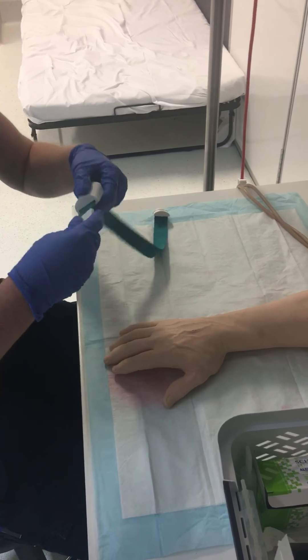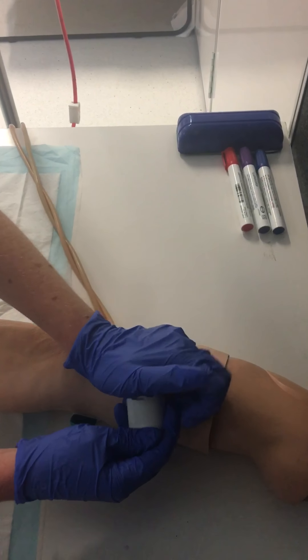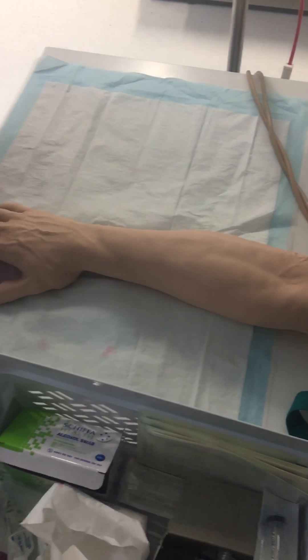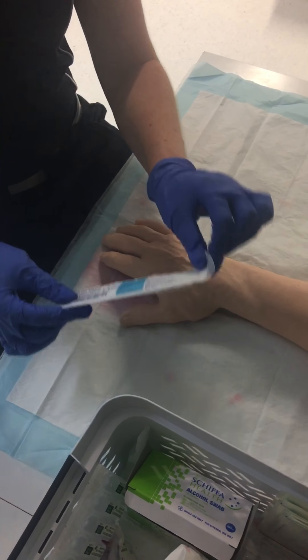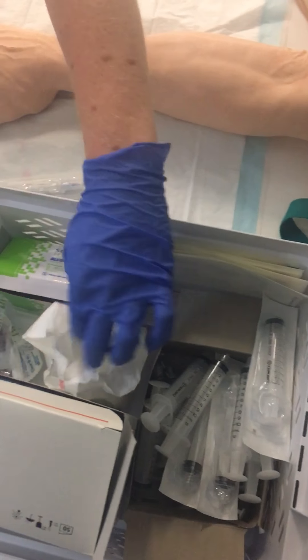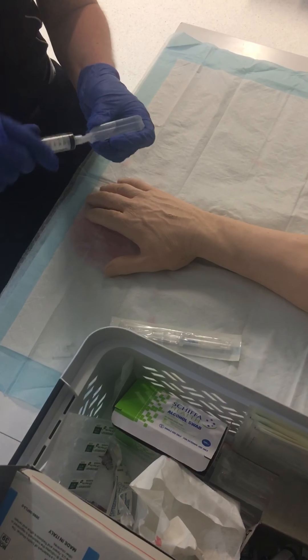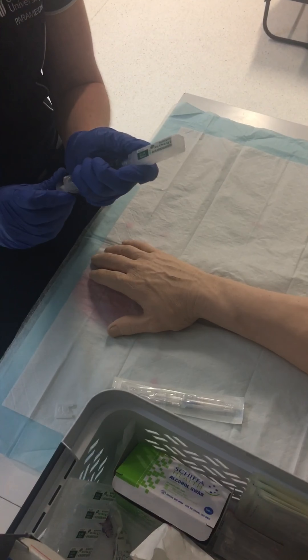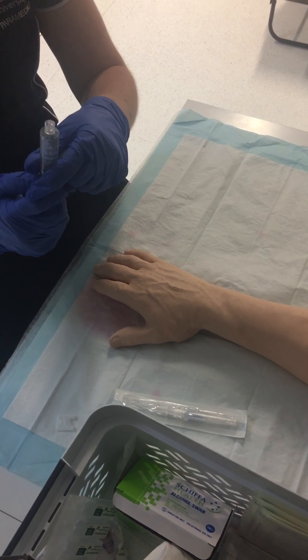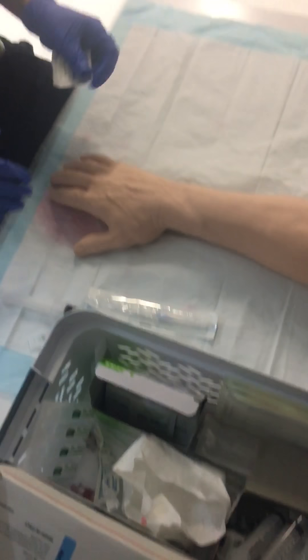What I'm going to do first is put the tourniquet on. I'm just tightening that up, making sure I don't pinch the skin. And while I do that, I'm going to prepare my equipment. I have a 22 gauge cannula, my syringe and my flush. I'm just popping everything on the bluey to make sure that I maintain a sterile environment.